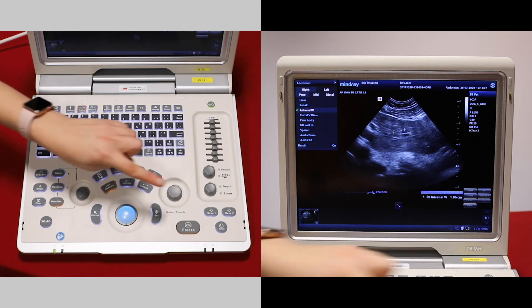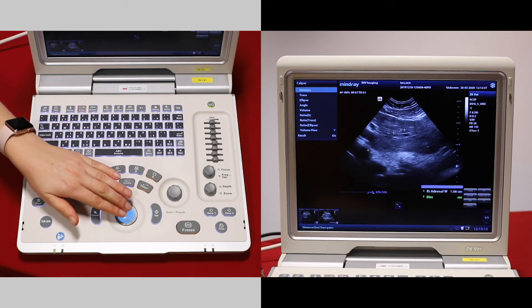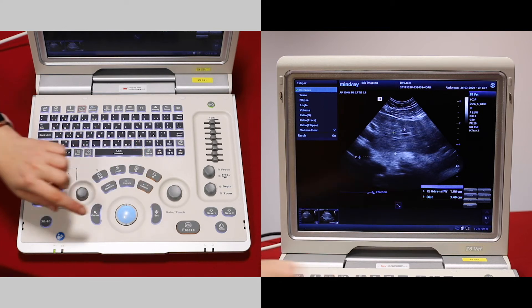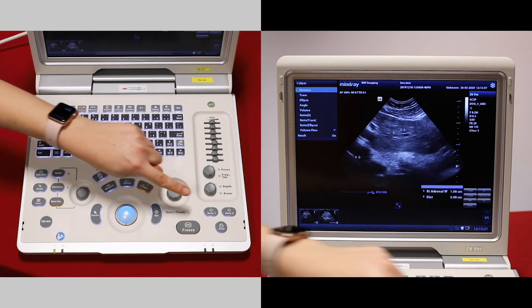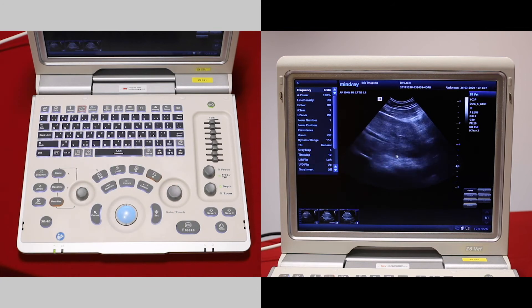Your measurement is labeled here. Remember to save. Alternatively, if you press caliper, make your measurement as before and just the distance is shown on the screen — this isn't labeled. Save to save to the hard drive.